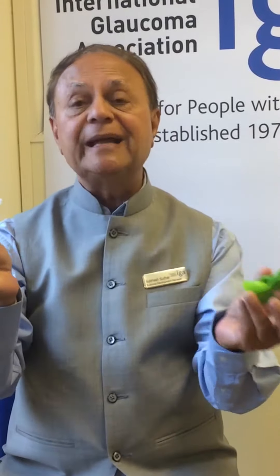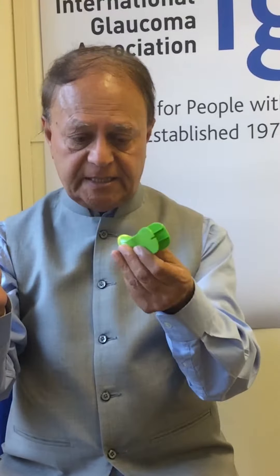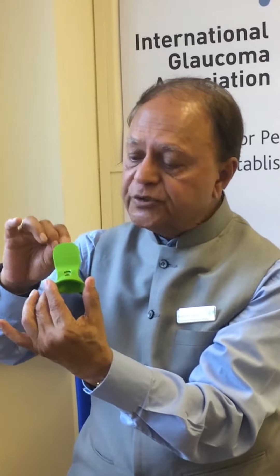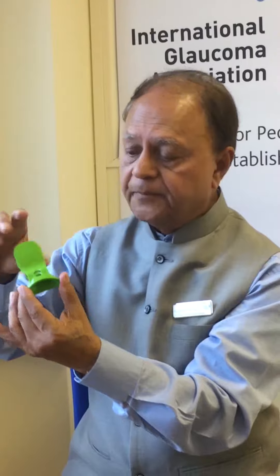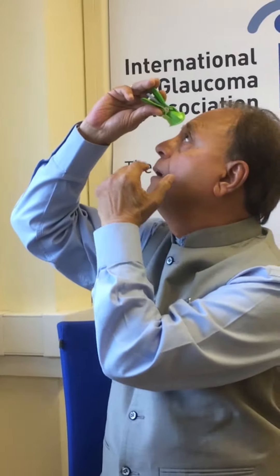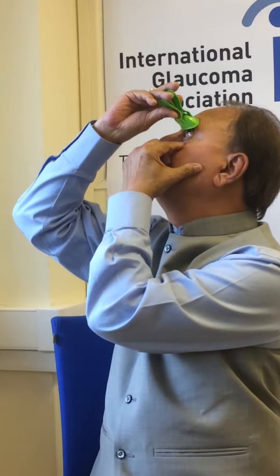There is another device for people with dexterity problems — a really very convenient one which has got two flanges, or wings. Using the same principle, push the single dose unit straight in. There is a hole at the top so you can look into it, and you pull the lower lid down.